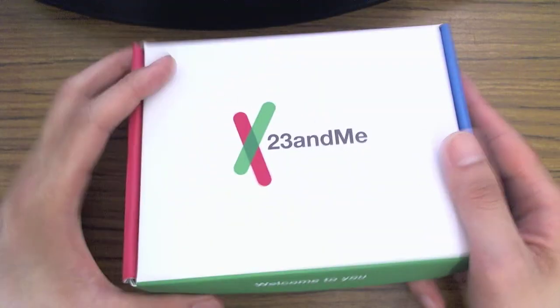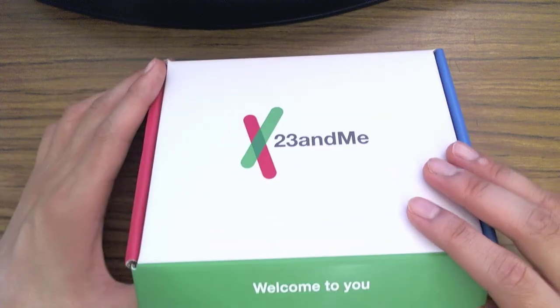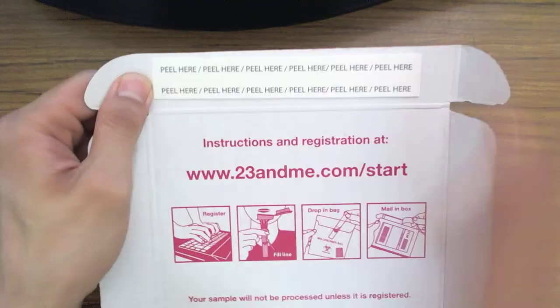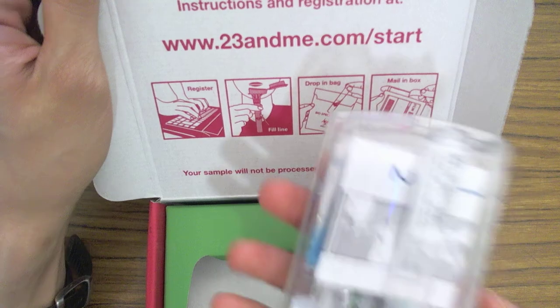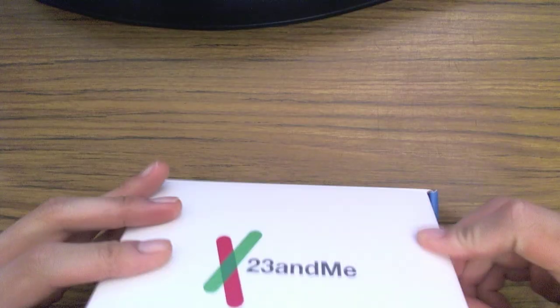This box came in the mail and there was also a return envelope, which I don't have with me right now. So let's open up the box and see what we have in it. Right at the top you can see a peel here, because what you're going to do is spit in this test tube and seal it by peeling off this adhesive and sticking it on before sending it back.